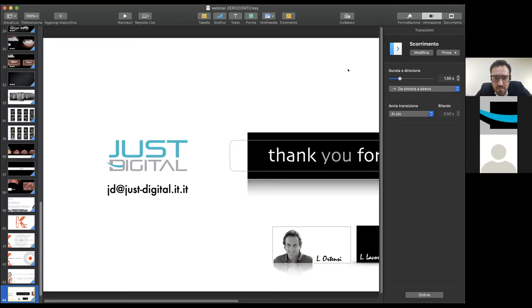Yes, good question, thanks. I think the implant surgeon has to be the protagonist of the design of the template. You have to calculate a space for raising the flap, okay? Or you have to calculate exactly your incision line, for example so that anchor pins do not limit your incision. Or, for example, you have a GBR procedure and you cannot have a hole in your flap. So we have to project it perfectly thanks to the engineer, okay? And in a digital way, it's so simple, okay? Like in this way, okay?